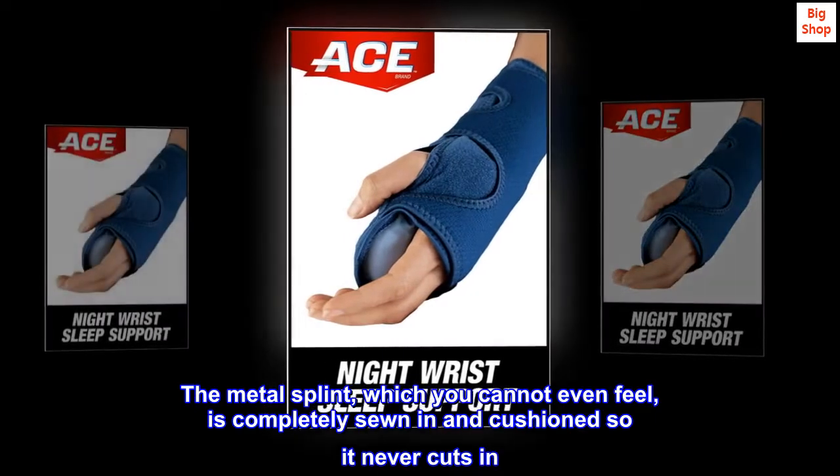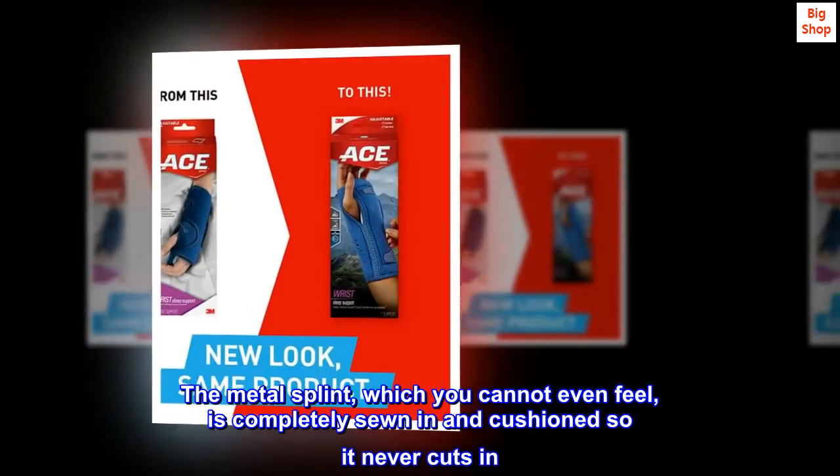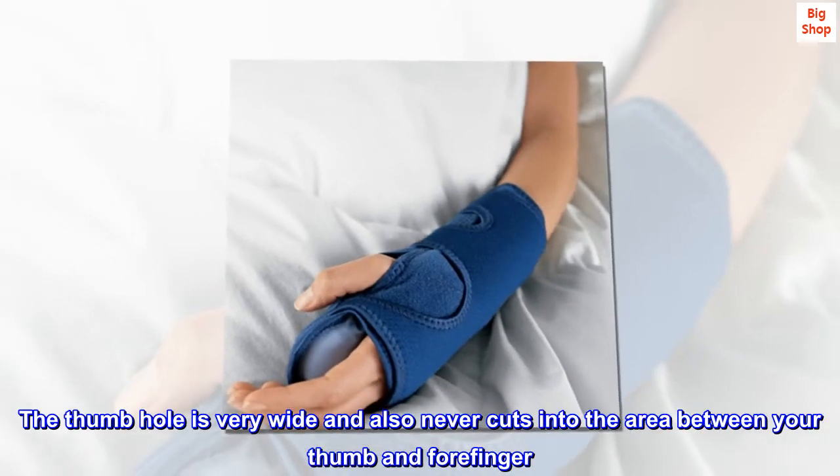The metal splint, which you cannot even feel, is completely sewn in and cushioned so it never cuts in. The thumb hole is very wide and also never cuts into the area between your thumb and forefinger.